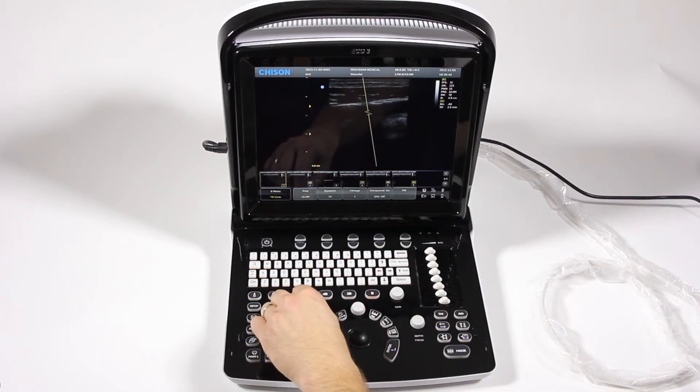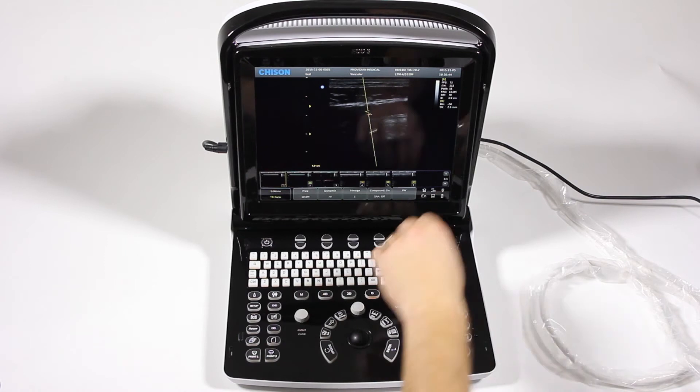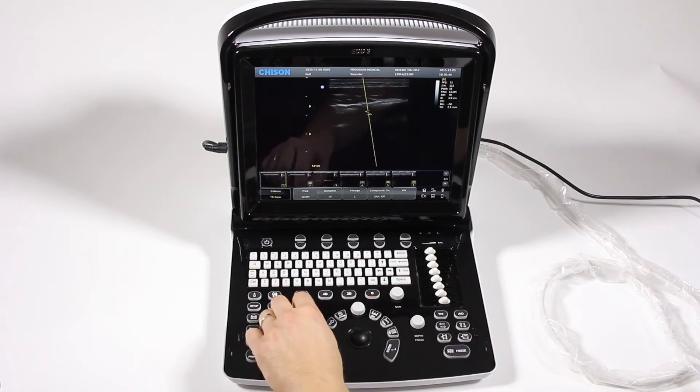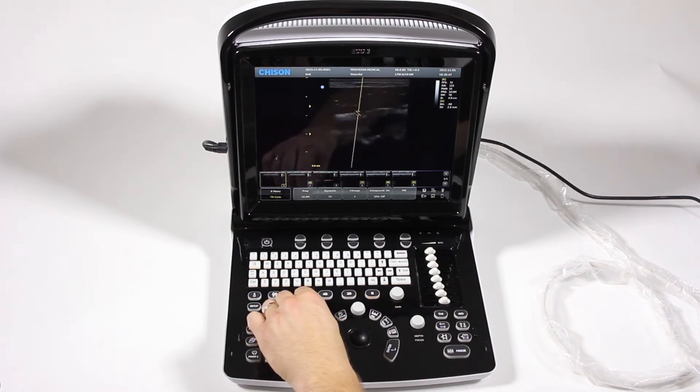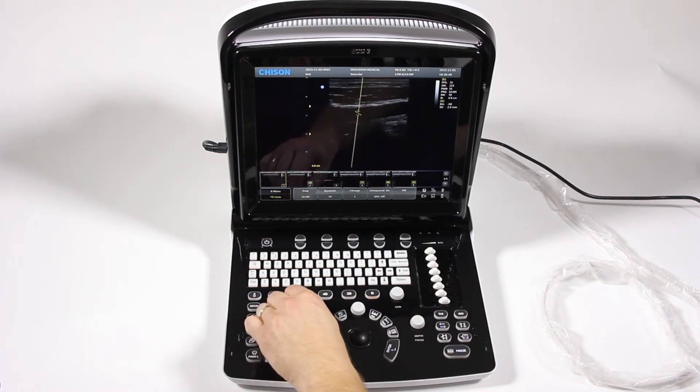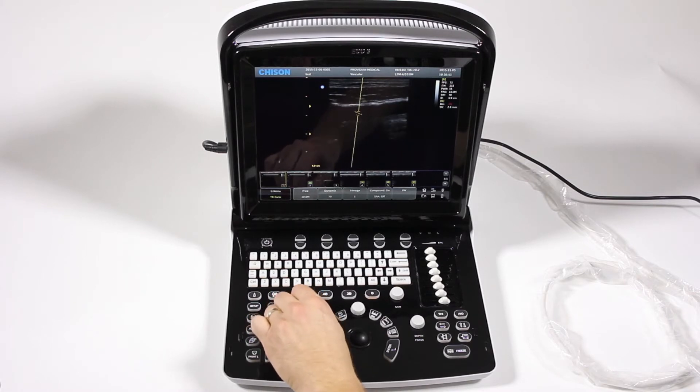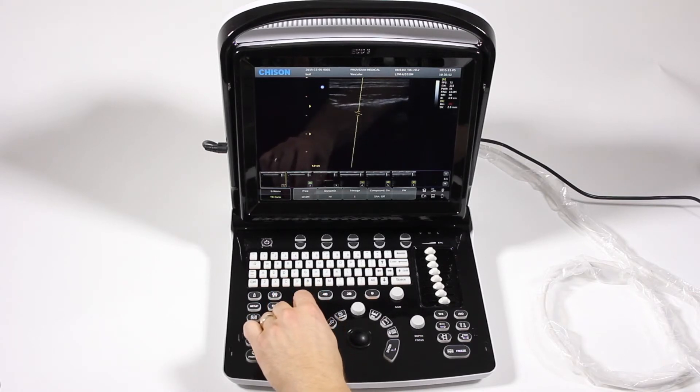And you see that your angle is displayed up here. So again, you push it down, and you'll steer that whole beam, and you'll get your angle correct right there.